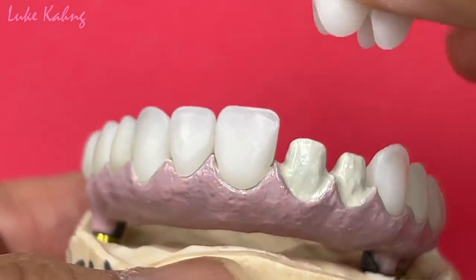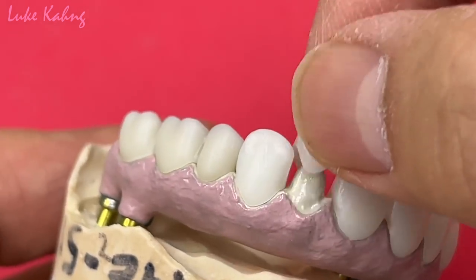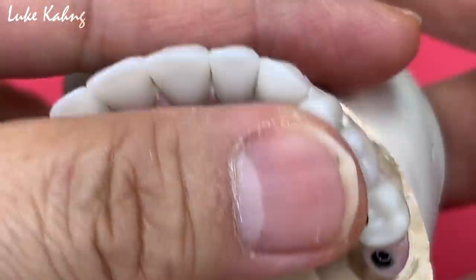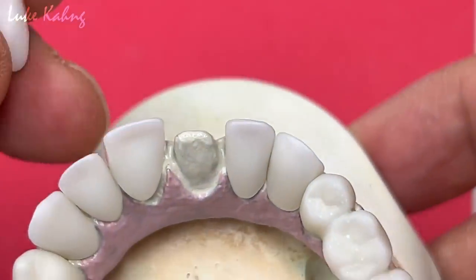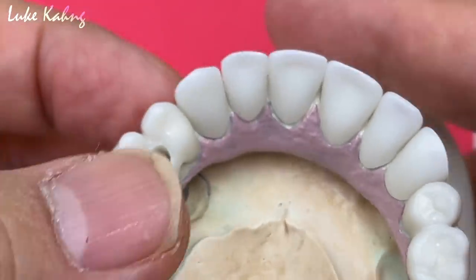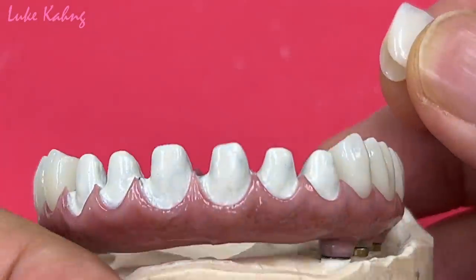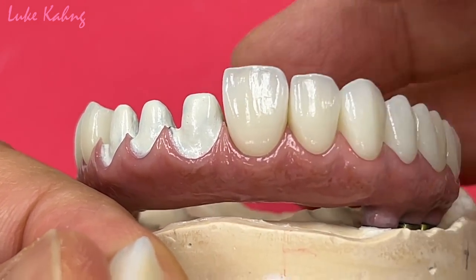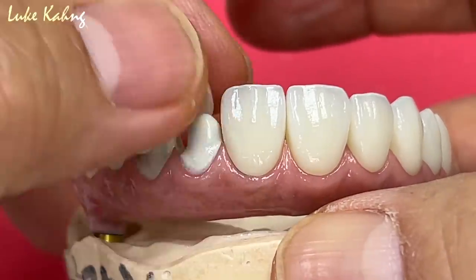This is a frame design after pack. We made the zirconia top, just make sure to hold this. So we're going to add micro porcelain on the facial area, but lingual is all zirconia. Let's go, 3 units on the back side for this one. So coming up, 7 Star cases. All right, this is the finals, singles. Seven Star case. Finally finished it, now ready to cement.